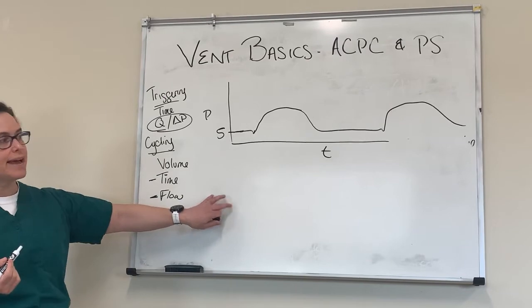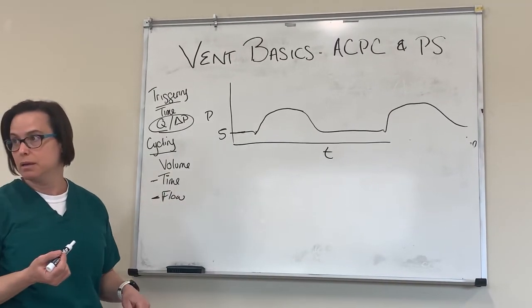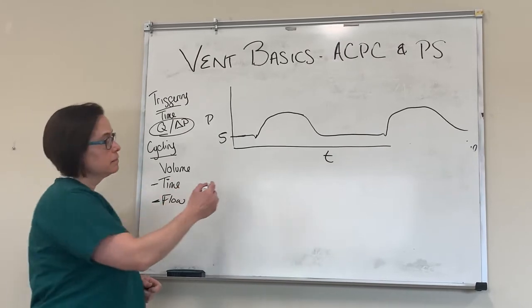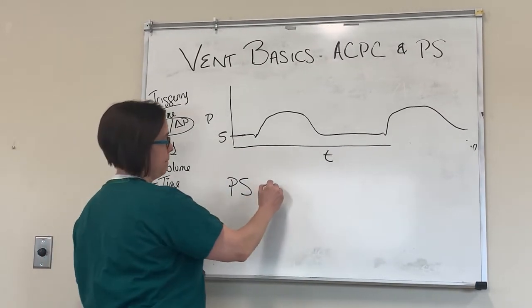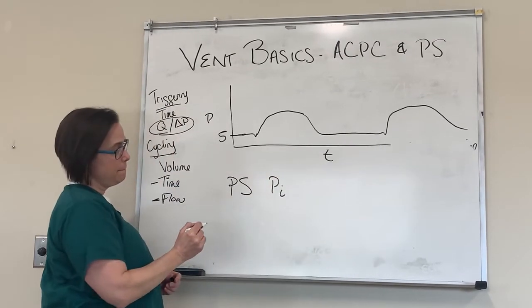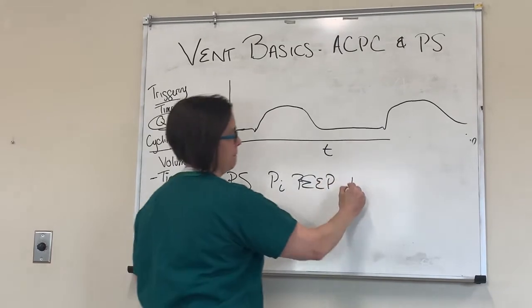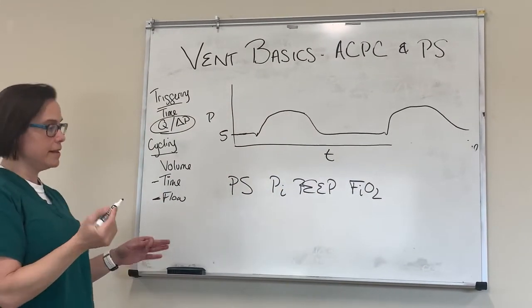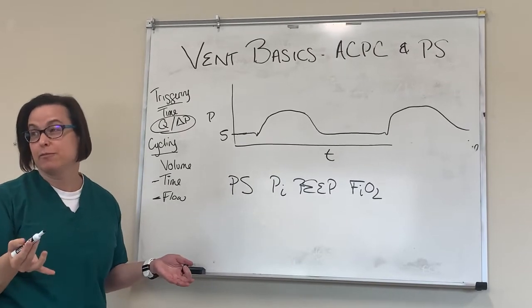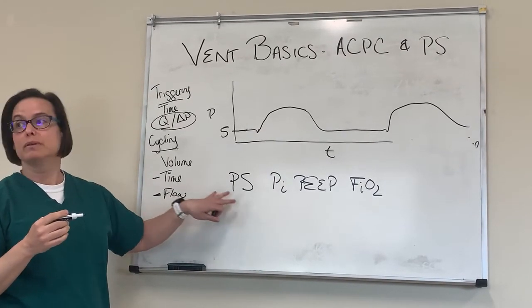So what do I need to tell a respiratory therapist if I want them to set my patient up on this? So for pressure support, it's going to be inspiratory pressure, a PEEP, and FiO2, and then the backup rate. And then a backup rate, which we set into it, usually like 4 or so, 4 to 6. Okay, so, but not really the rate that we're expecting them to use.